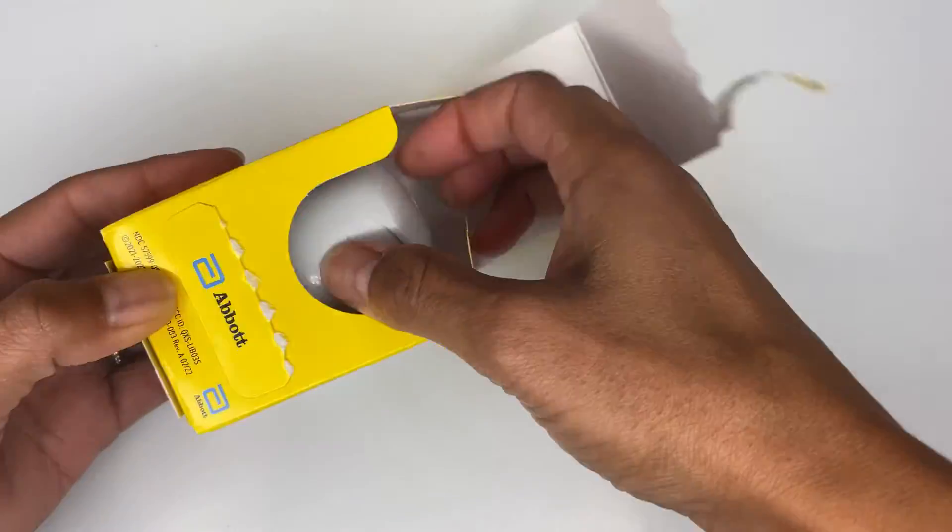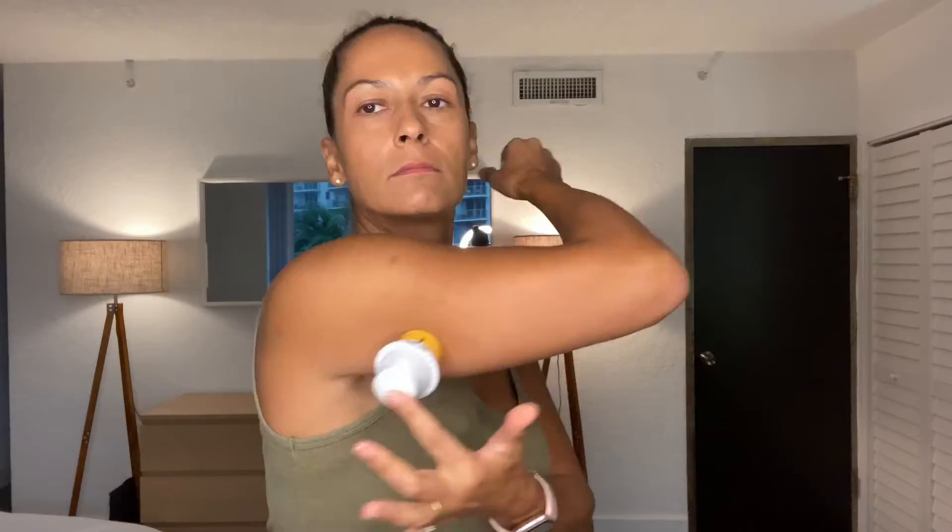First I'll show you how to insert the Freestyle Libre 3 sensor, then I'll give you an overview of what Libre 3 can do, how it's different from Libre 2, and of course how I like it. So let's get the sensor on. The sensor is super easy to apply. I've worn it for two weeks — let's talk about it.